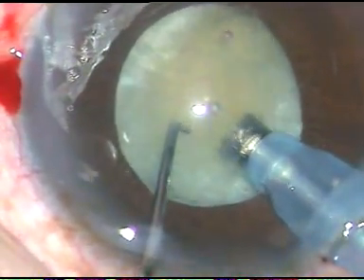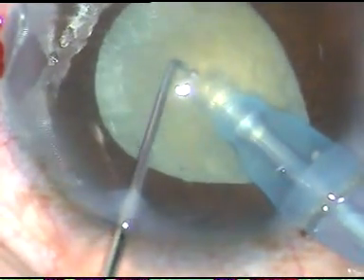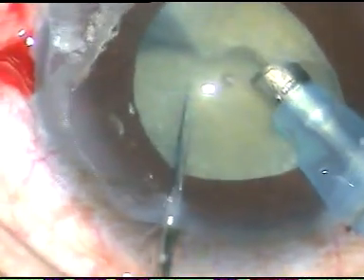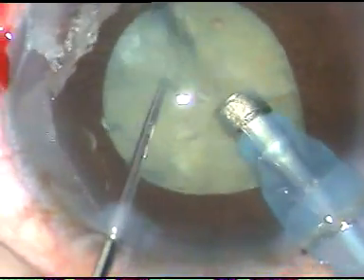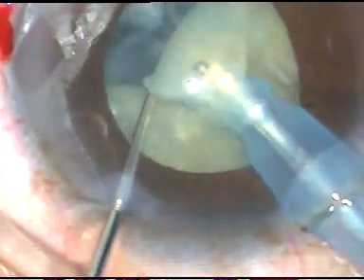Very cautiously, I hold the nucleus, and here it is the first chop. And here it is the second chop. And this triangular nuclear fragment which is free is gently removed.